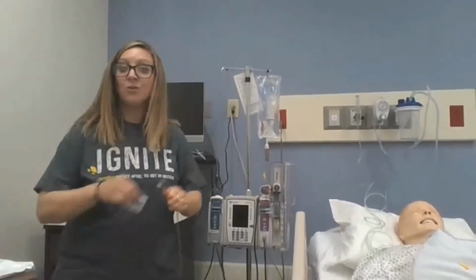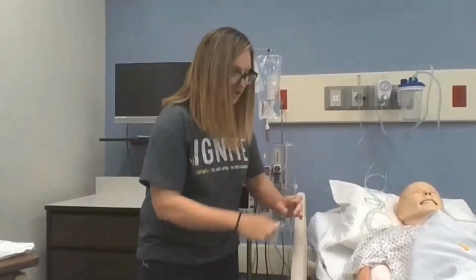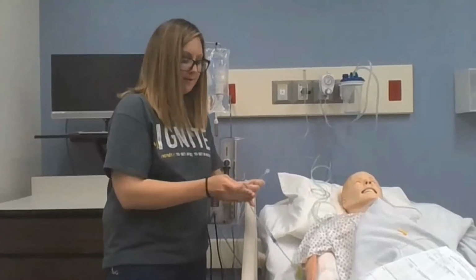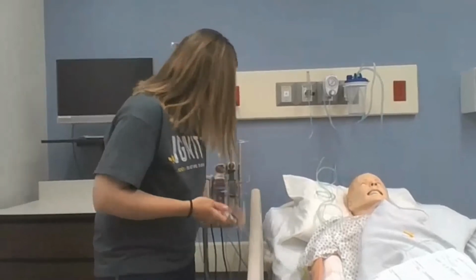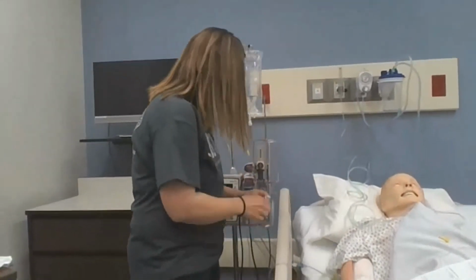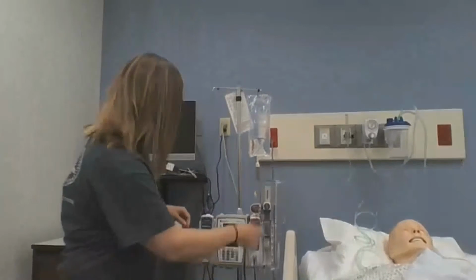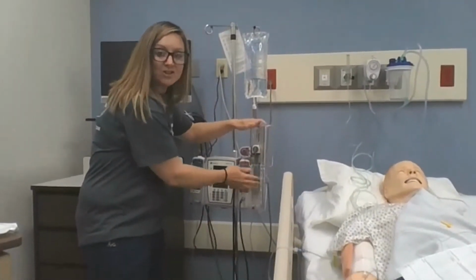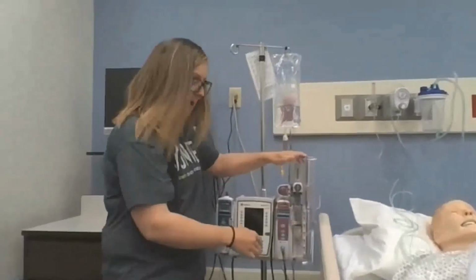And then we are going to, of course, I would have gloves on for that admin. And we are going to attach this to the port closest to the patient. I'm going to clean here. And attach my tubing. And make sure that your tubing remains clamped. You don't want to accidentally bolus Dilaudid or morphine to a patient. So make sure it remains clamped till you're ready to run your pump. We've got that going. I'm going to push this little clear chamber here. It's just kind of like a jacket that holds the syringe directly into the pump there.